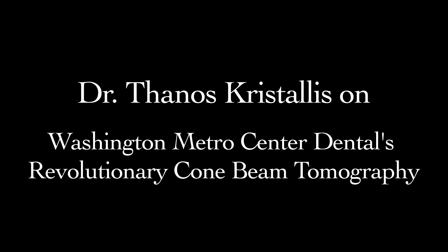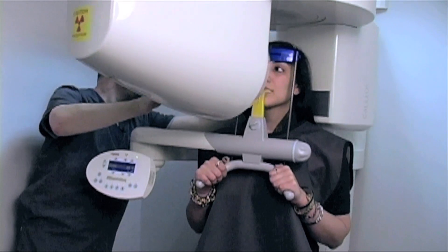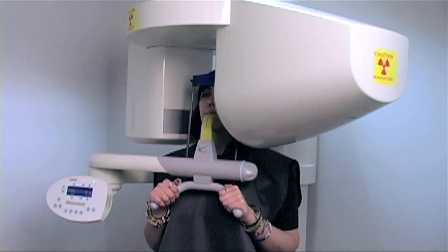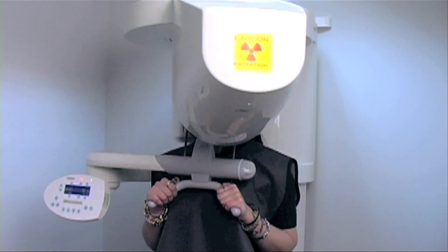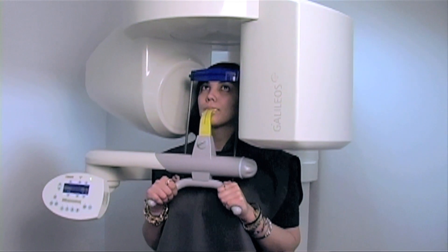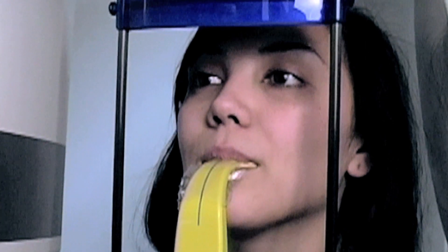I'm just going to rotate this and make sure we're clear — looks like we're clear. What we're doing today is using cone beam computed tomography. We can take an x-ray in 14 seconds, which gives me all the information for the whole maxillofacial area. I can take that and virtually do my surgery before I even touch the patient.